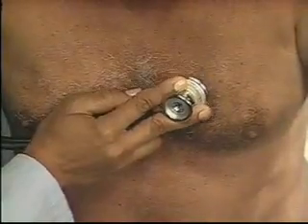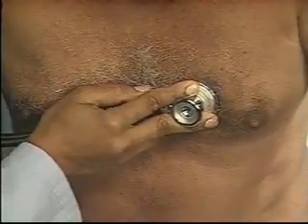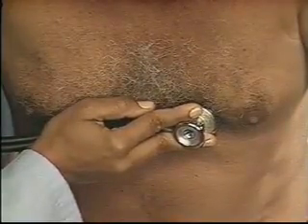Pause periodically to allow the patient to breathe. Listen for the high-pitched diastolic murmur of aortic regurgitation. If the patient had this murmur, it would sound like this.